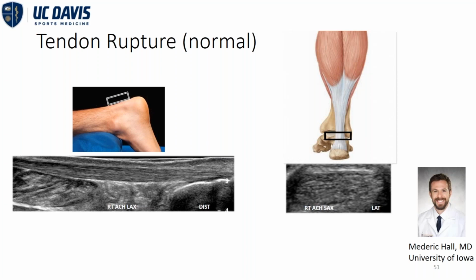In most structures in the human body, you're going to want to visualize in 2 axes. In ultrasound, we commonly say long axis and short axis. If you're speaking to surgeons, sometimes it's useful to break it into more familiar nomenclature, such as sagittal, transverse, coronal. But here, we'll just use long axis. If you place your high-frequency linear transducer in long axis, commonly we'll place the more proximal structures on screen left and the more distal structures on screen right.